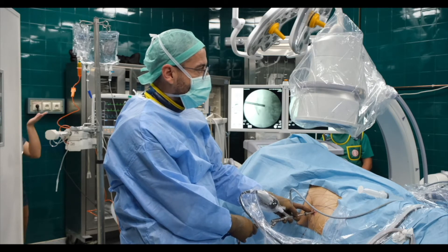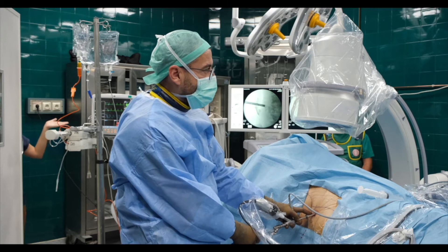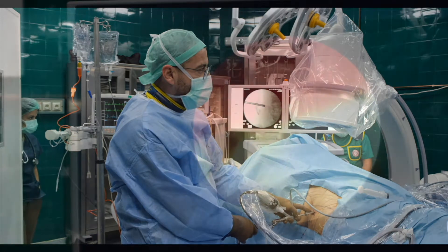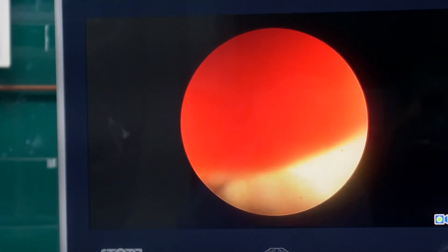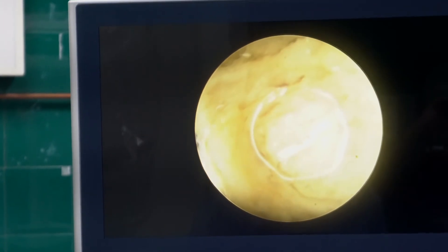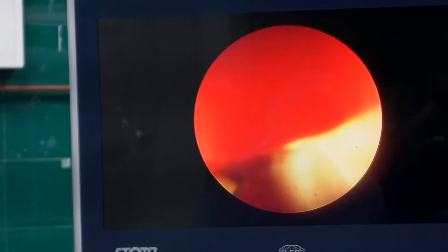This device uses ultrasonic energy for fragmentation and at the same time it continuously aspirates from the system. Sometimes if you need more aspiration you can activate it, then just wait a little bit for the system to fill again. Fragmenting from the peripheral part makes it much more efficient.